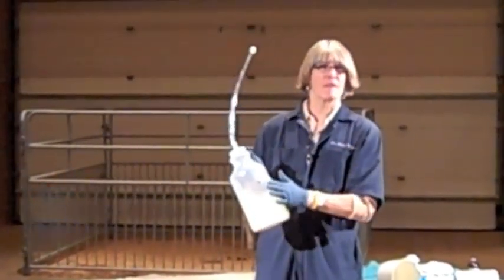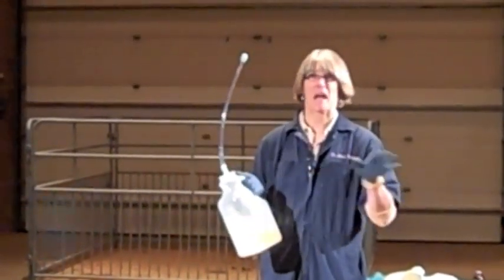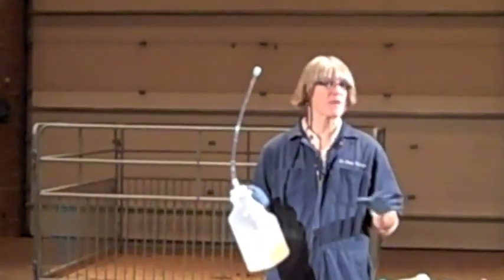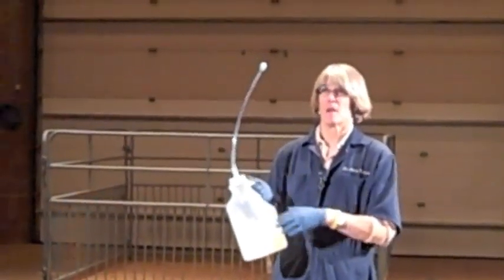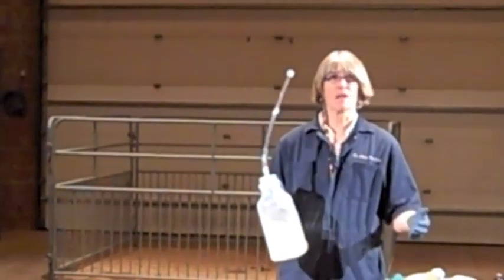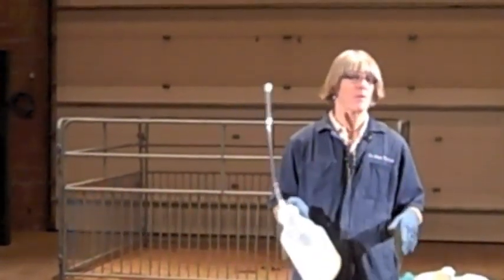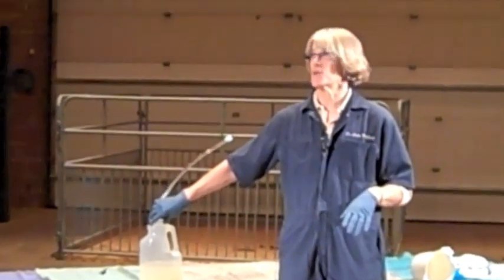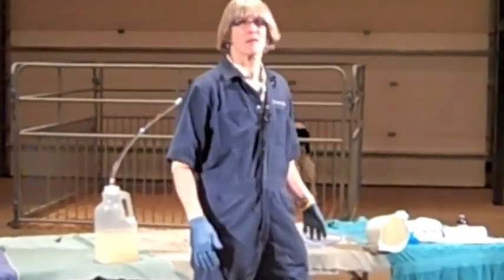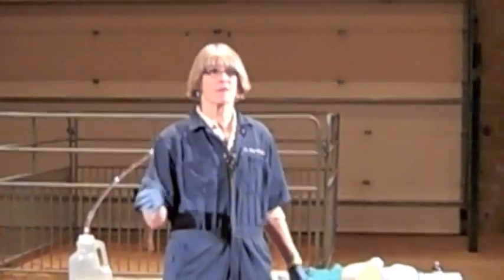So, enough esophageal feeders so that you have one for every calf born that day at maximum capacity. If the largest number of calves ever born is eight calves, I'd like to see eight of these on the farm. When you finish one calf, it can go into a disinfectant solution and be clean, and then rinse them out, put them on a drying rack, and they're ready for use the next day. Very dilute bleach, or whatever sanitizer you use, is very effective — but rinse it before you use it again.